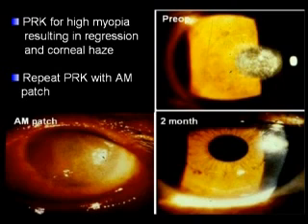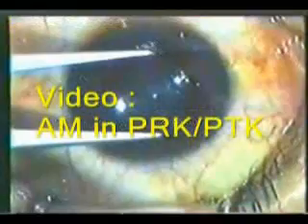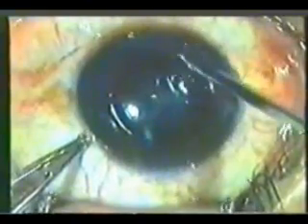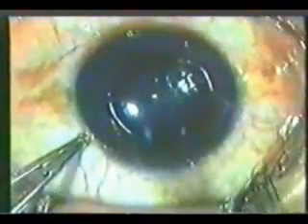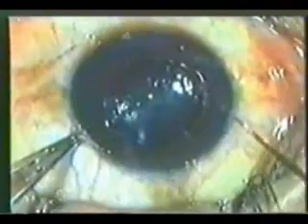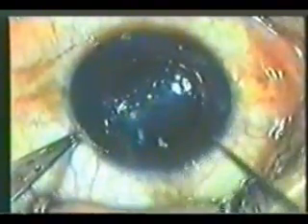He repeated the PRK and used amniotic membrane as a bandage. Here we demonstrate how the cornea looks two months later. In this video kindly provided by a doctor from Brazil, a patient with cornea haze due to previous PRK for myopia — he made a marking and then scraped the epithelium with a Tooke knife. The purpose is to repeat PRK and to produce a new refractive surface without the cornea haze.